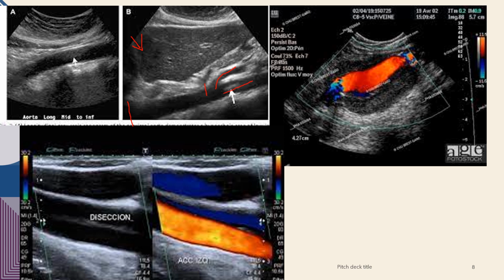Now, within that proximal region, you are going to identify here the celiac axis, the superior mesenteric artery, the aorta, and then if you see an anechoic transverse circular region in here, that would be the left renal vein coursing from the left kidney towards the IVC.